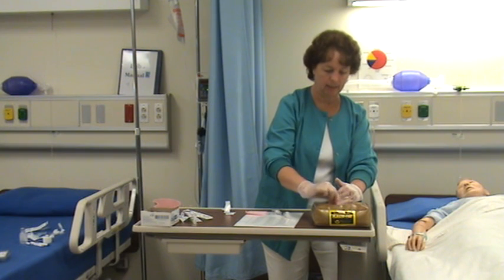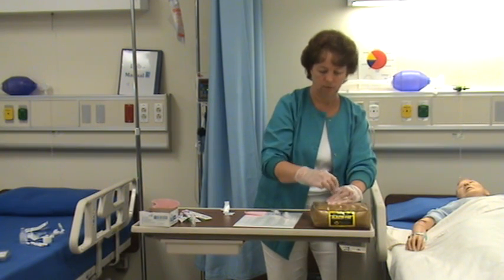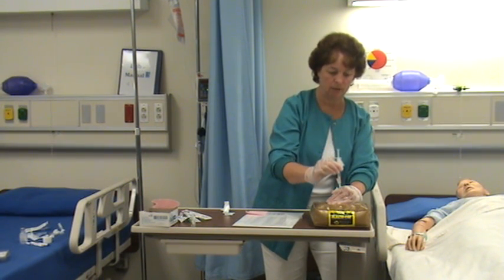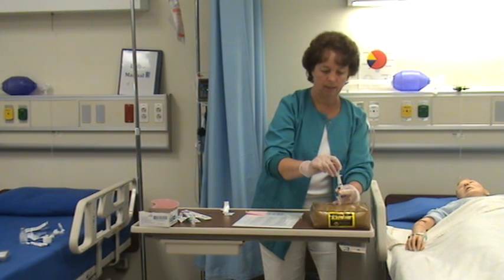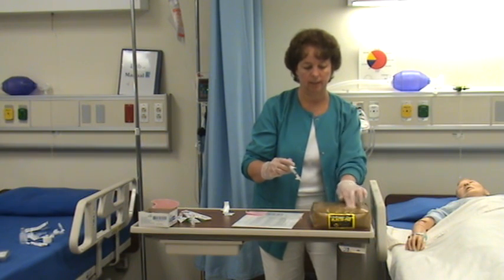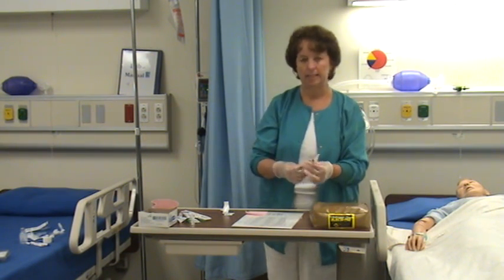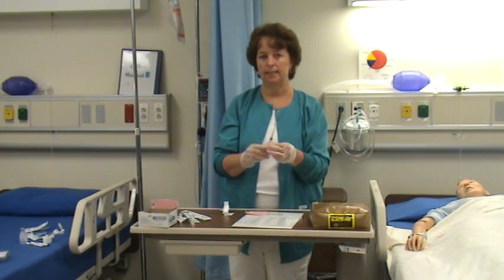I've picked my site and cleaned it, starting from the center going around. Hold onto the tissue, then draw out the needle cap, administer it at a 90 degree angle, aspirate, and inject. You can hear that little bit of air going in at the end. And that's administering an IM injection using an airlock and Z-Track.